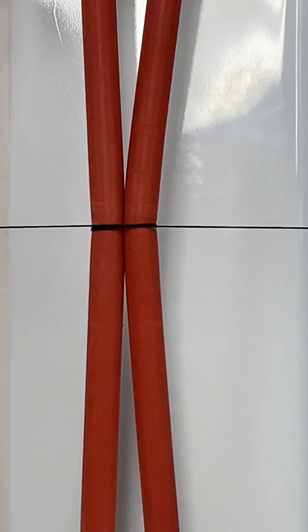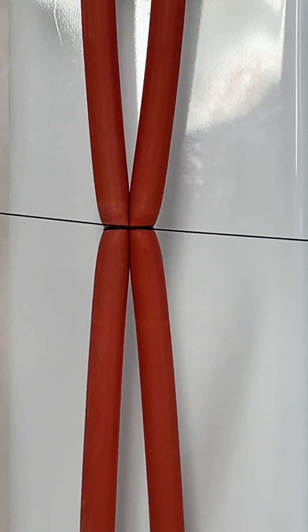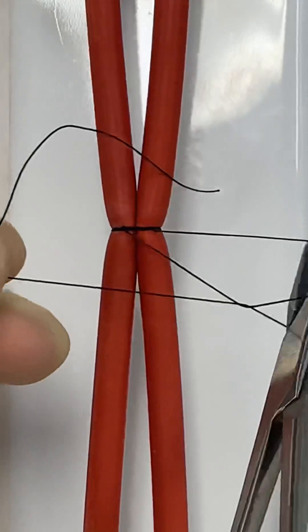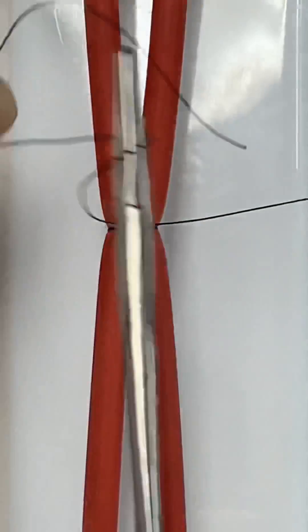The overlapping loops create higher friction in the knot portion of the ligature, which prevent it from loosening before a series of square knots can be tied.